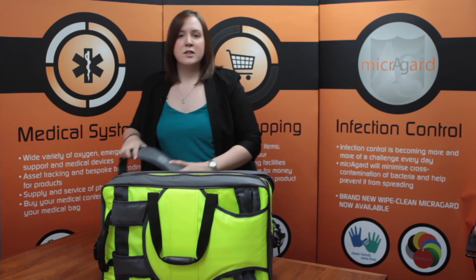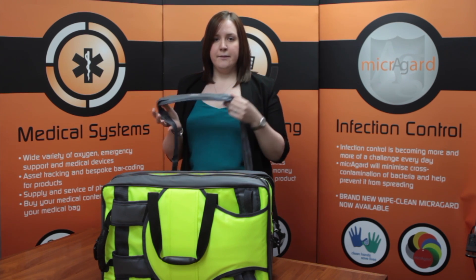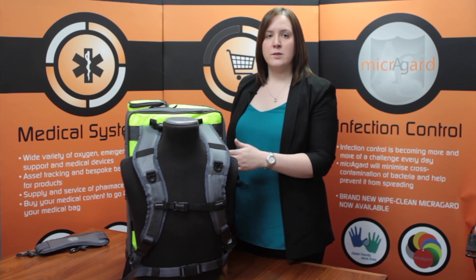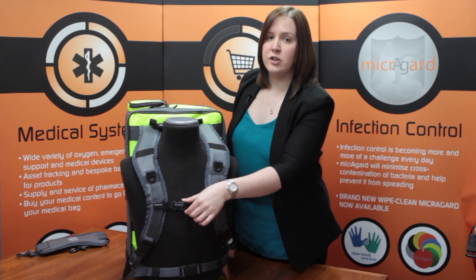It also has an adjustable shoulder strap with an ergonomic comfort pad to carry it horizontally. The back panel is designed to provide maximum comfort with ergonomically shaped backpack and waist straps with an adjustable sternum strap for extra security.